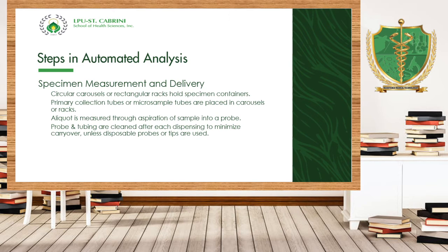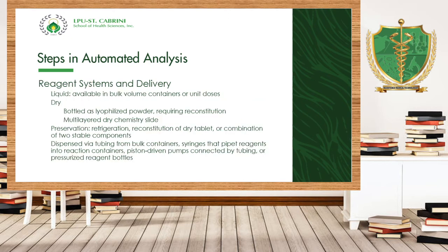Now, kagaya po ng sinabi ko sa inyo, Vitros uses disposable probes or disposable microtips per sample, per test, per specimen. Okay? Pero kung wala at probe ang ginagamit, no, kailangan mo nang i-rinse yan ni machine to eliminate the carryover. Now, how about for reagent systems and delivery?